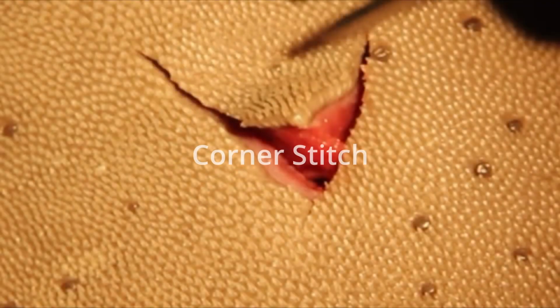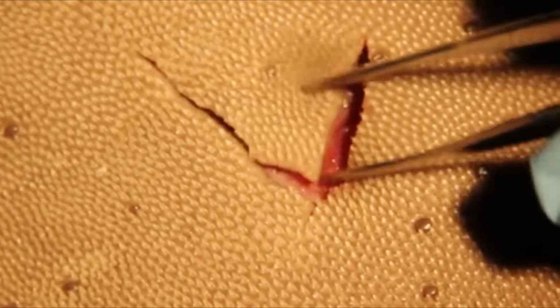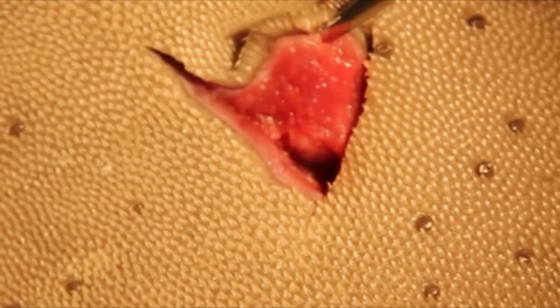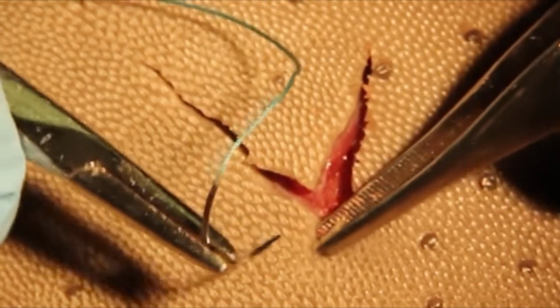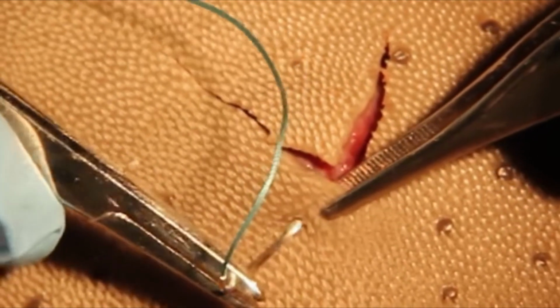strangulated. Corner stitch. The corner stitch is used for a triangular flap or a corner laceration. The whole point is to secure the tip without strangulating it, because corner tips are the easiest part of a wound to lose. Start on the first side of the wound.